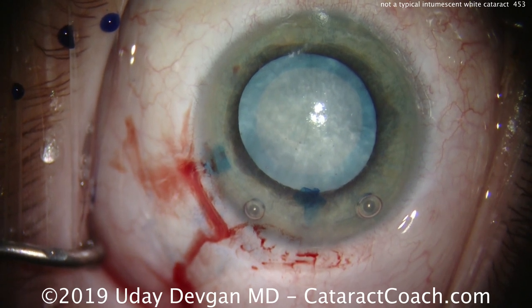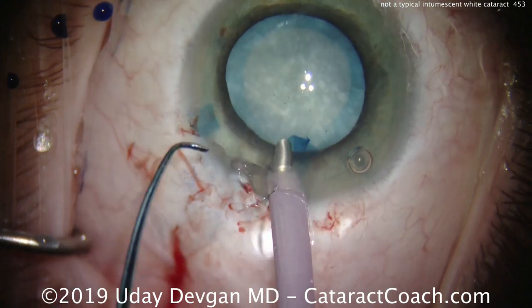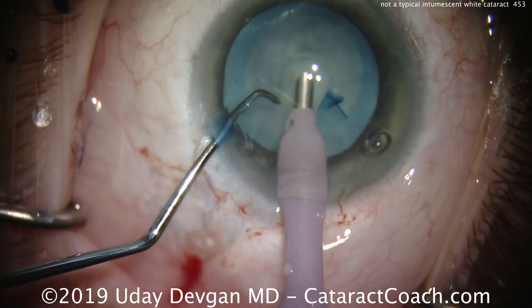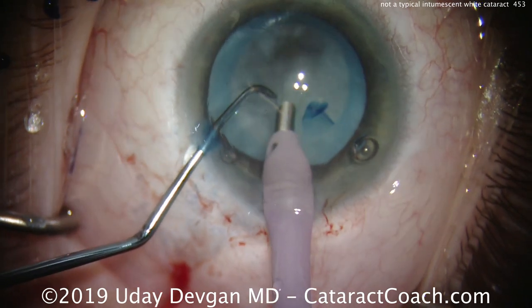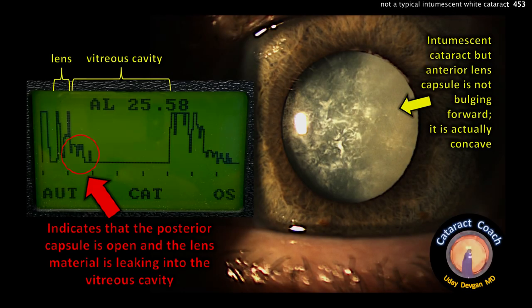There's no need for hydrodissection — we're not going to do that at all. In fact, look what happens when I just put the phaco probe in the eye with just infusion pressure: look how deep things get. And when we try to aspirate any of the lens material — look at that — the posterior capsule is wide open. Look at the pre-op picture again.